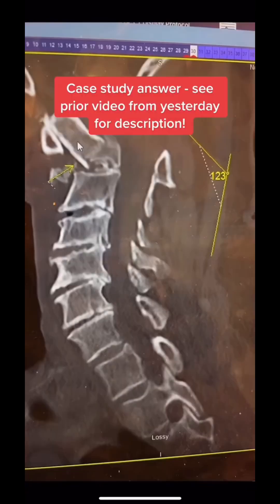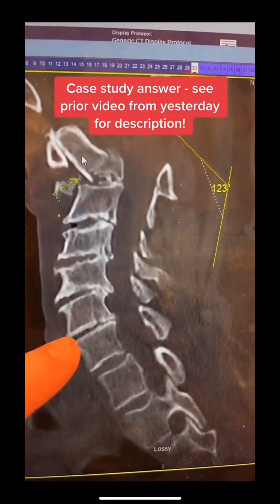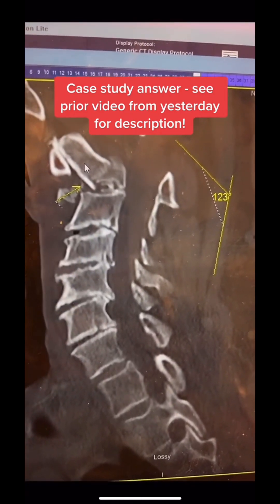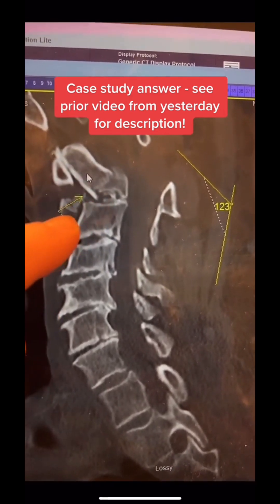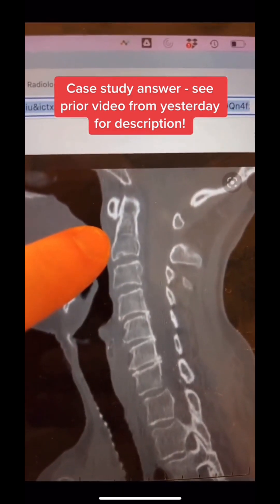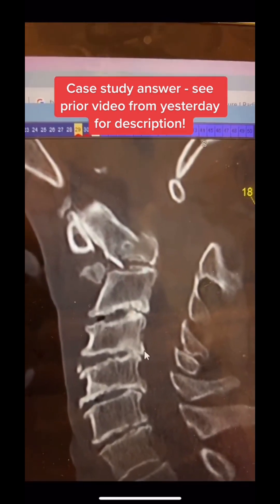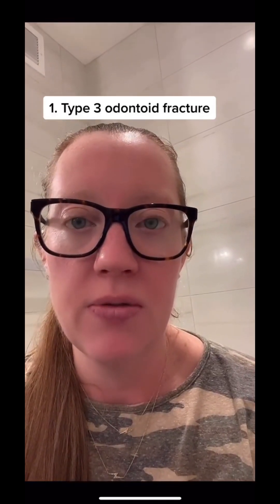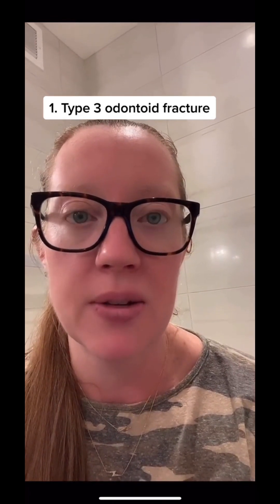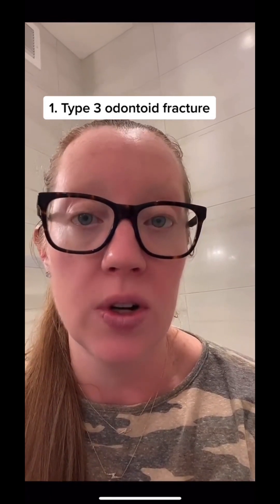So let's go through the answers of this case study. Remember, we have a 56-year-old female who suffered a ground level fall with severe neck pain and weakness in her arms and legs. The CT imaging shows degenerative disc disease, but more importantly shows this severe fracture. The bone that should look like a triangle-shaped bone now looks fractured across with a piece jutting out. This is a severe type 3 odontoid fracture, which is highly unstable.